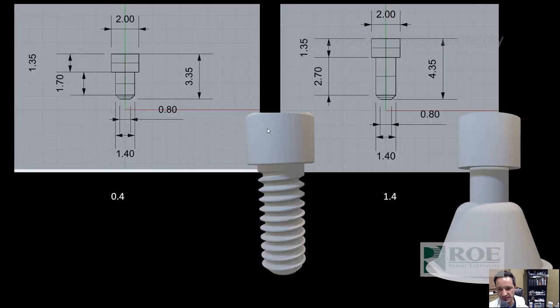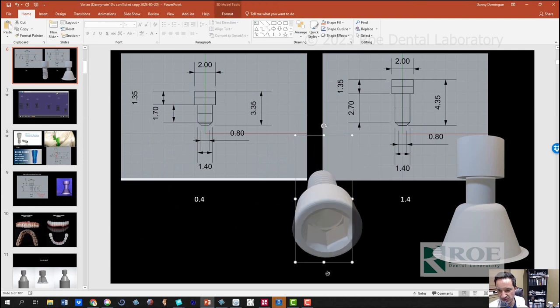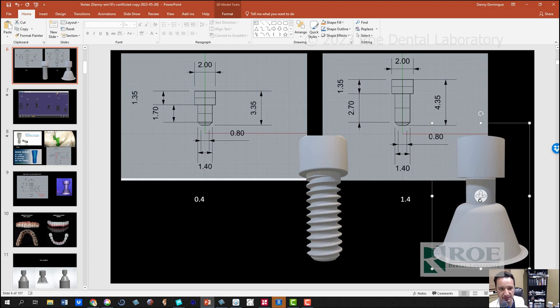So let's get away from that. On the left picture is the mini screw, and on the right is the longer screw. This was the answer to our problems — to create a longer, taller screw where you could get more zirconia and prevent the fracture of these upper arches. This is the multi-unit abutment here, this is the screw head, and this is the amount of zirconia you would get underneath the screw head — 1.4 millimeters is the exact amount you would get underneath.